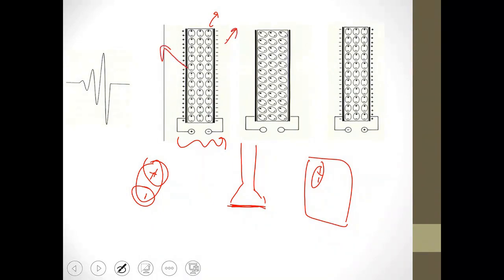The molecules or dipoles have this orientation. Now, if I turn this on, I am applying the electric field. I will then remove this pulse or electric field application on the electrode. What will happen? The molecules or dipoles will start to relax. Once you remove the effect of the electric field, they will begin to return to their original structure, which I initially applied to them. All right?